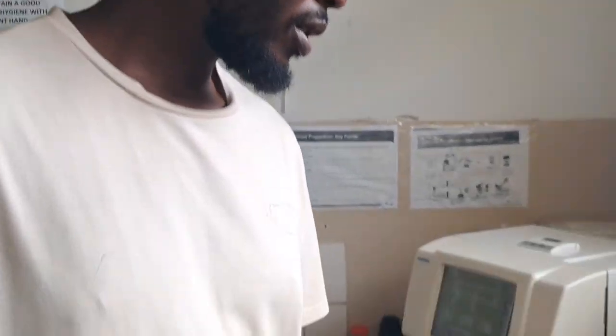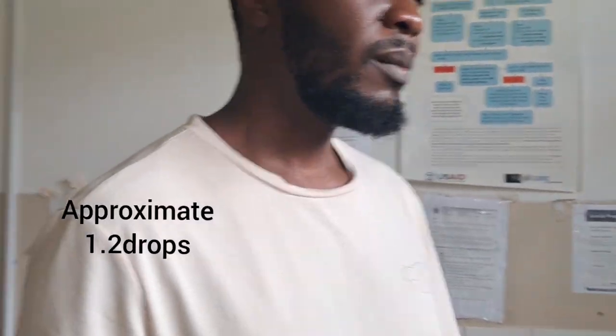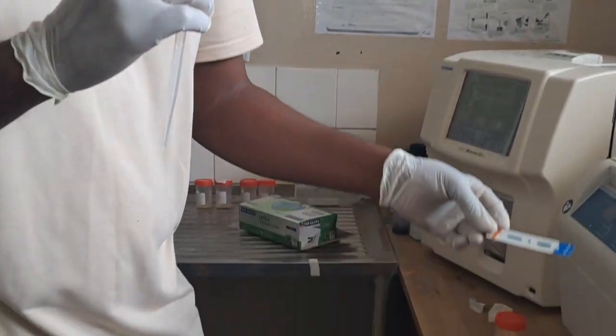Then in the lab, we have what we call a micropipette. It is able to measure exactly. For LAM, the sample that you need to put on the RDT is 60 microliters. 60 microliters is equivalent to about 1 point something drops. Since we have a limitation of those microliters, we can just put one big drop on the RDT.